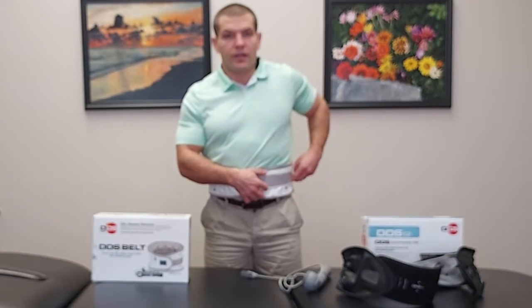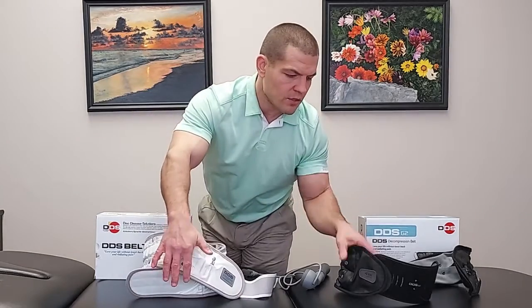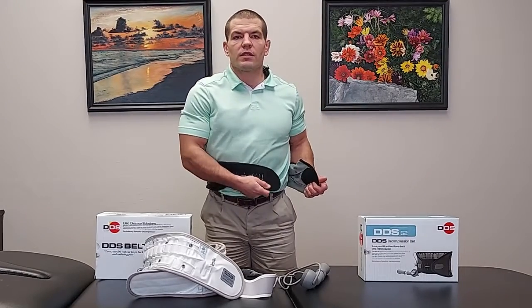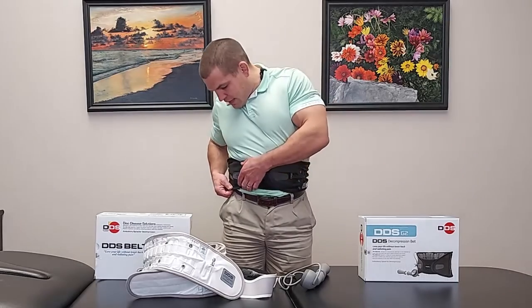Now putting on the DDS-300 — this is the original model, kind of the OG of their line, and it's been more well tested. The G2 is actually a little less expensive; they've tried to make it more accessible so more people can buy it. That said, you do get what you pay for to some extent, though the quality difference doesn't feel that significant — it may just be a lower profit margin.